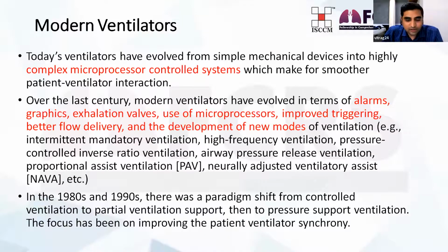Now coming forward to our modern ventilators, today's ventilators have evolved from simple mechanical devices into highly complex microprocessor-controlled systems, in which professional biomedical engineers have been playing quite a long role rather than mechanical engineers or others. So now the process is more about making patient-ventilator interaction smoother than just developing more and more ventilators. Over the last century, modern ventilators have evolved in terms of alarms, graphics, exhalation valves, use of microprocessors, improved triggering, better flow delivery, and development of new modes of ventilation.